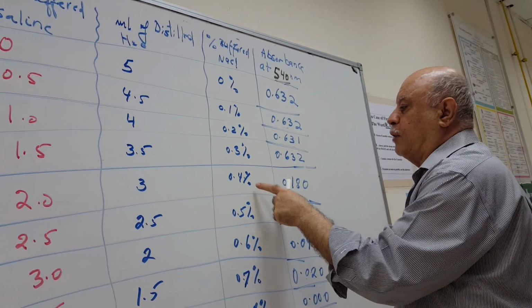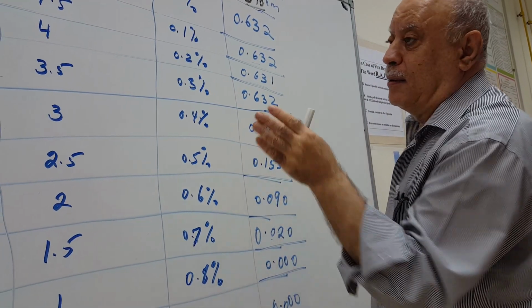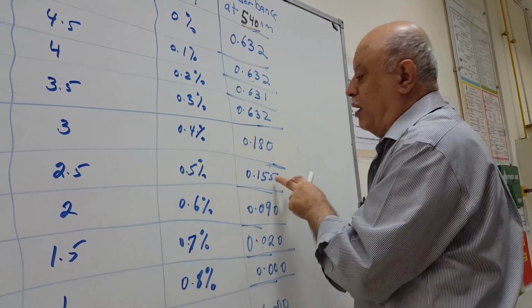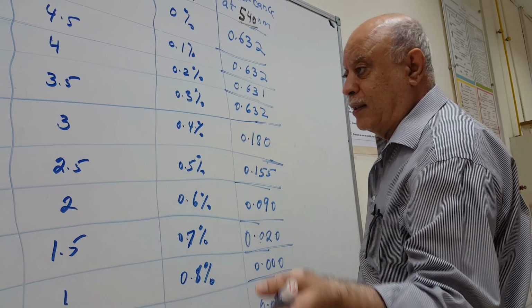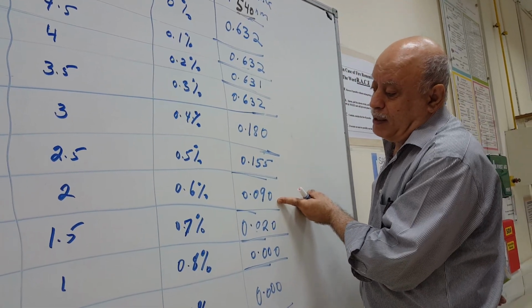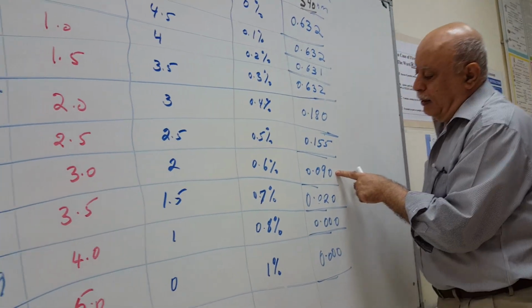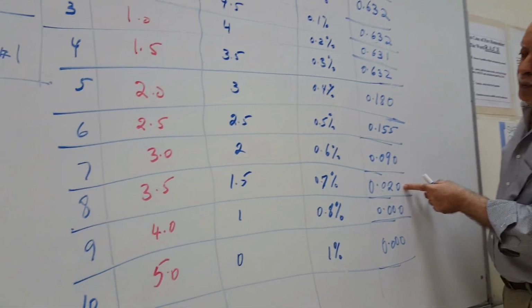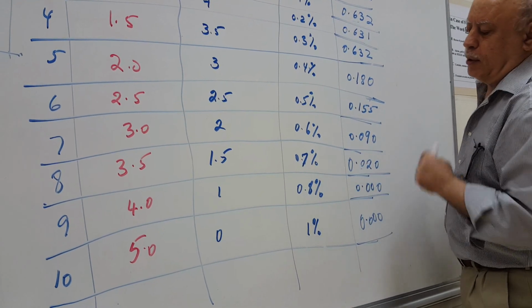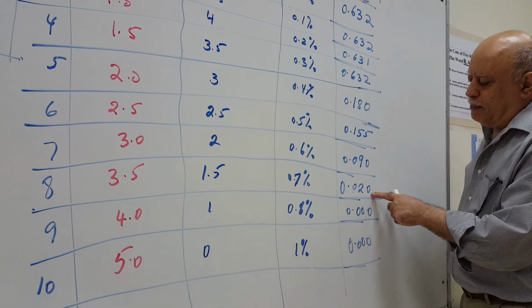Now, 0.4% gets less reading, meaning some is lysed and some didn't lyse. 0.5% we have less reading, much less for tube number 7 lysed. For tube number 8, because the concentration is hypotonic but not very hypotonic, we get a very small reading.